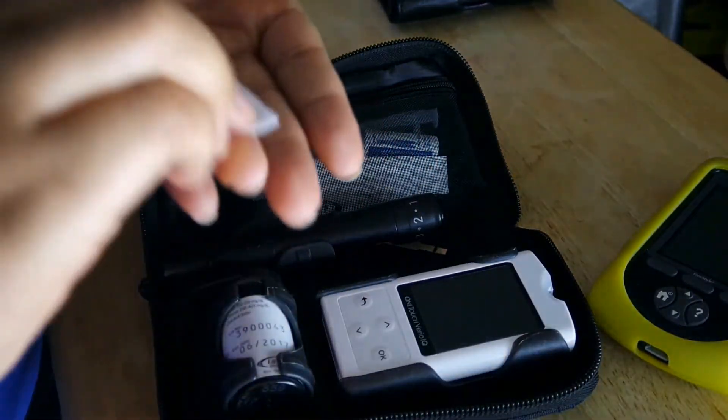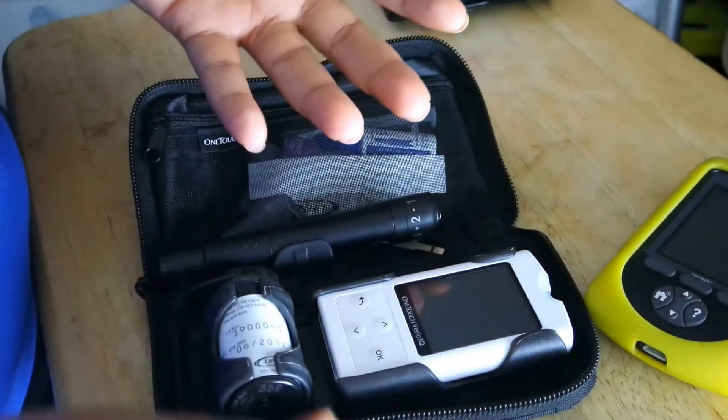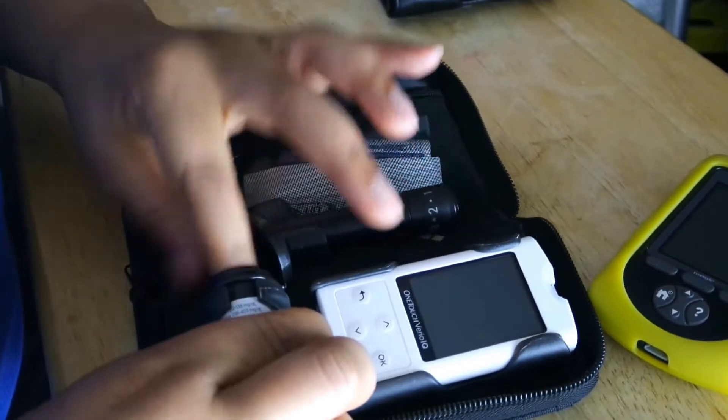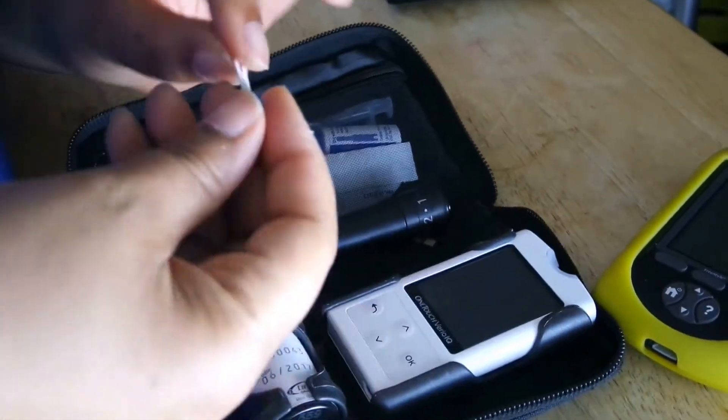Alright, first you want to take an alcohol wipe and clean your finger. I usually clean two just in case one decides to act up. Take out a test strip and insert it correctly into my monitor.